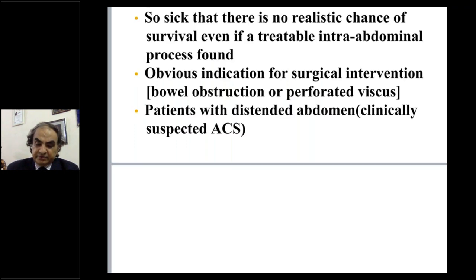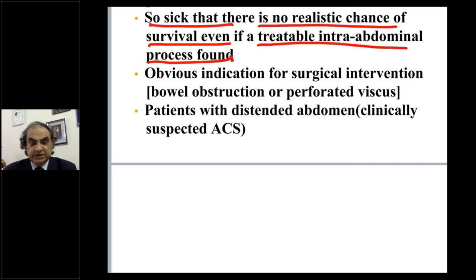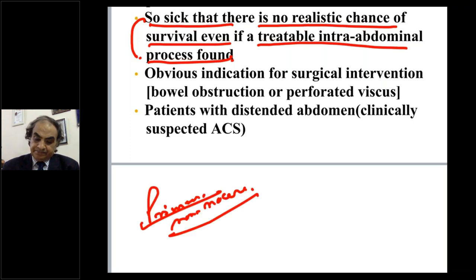They're so sick that there is no realistic chance of survival, even if the treatable cause is found. Very rarely would people recommend this in a very sick patient. If the patient is too sick even for a haircut, and you want to do a diagnostic laparoscopy, it will be taken as malpractice, frankly, because the patient was too sick to undergo it. Because we still stick to the same norm, primum non nocere. Above all, do no harm.